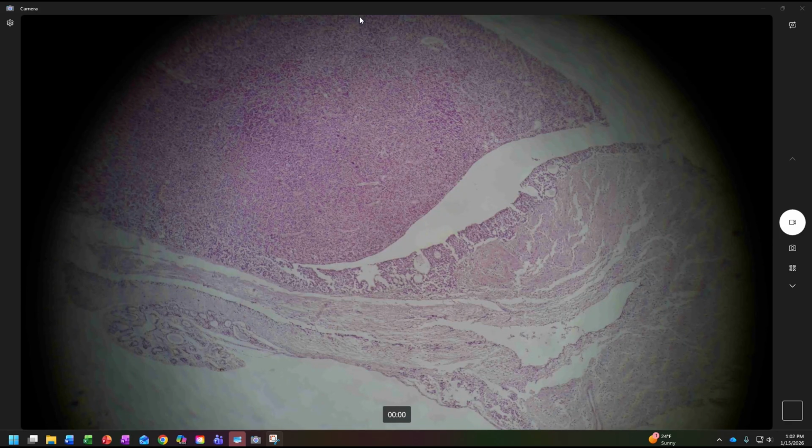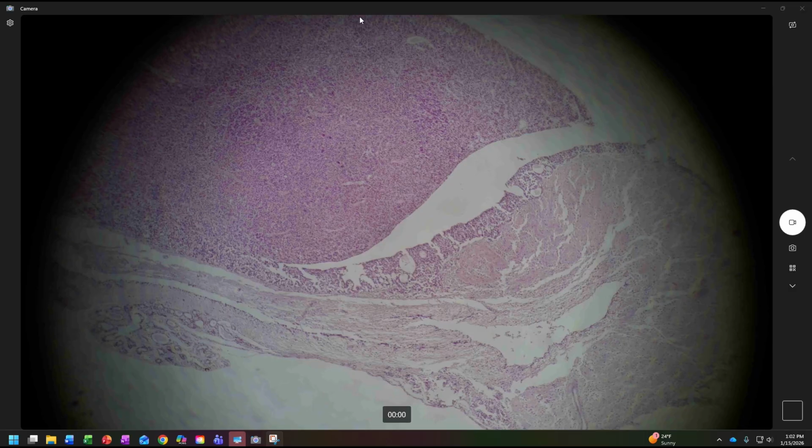All right, so here's the fourth and final slide of the pituitary gland that we're going to look at. I'm glad I said something about not falling into the trap of anterior on the right and posterior on the left, because here we go. How do we know this is a pituitary gland? We have this large, dark, grainy area.